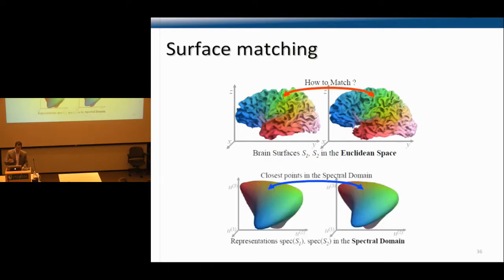So what we're looking into is transforming the Euclidean space into spectral domains. So instead of representing our shape in the Euclidean space, we'll do a transform to represent it in the spectral domain, and use the different eigenmodes to be able to match different shapes, for example, between one or two patients or between the different meshes that we have between CT and ultrasound.